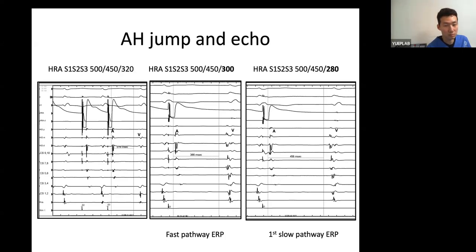But sometimes you look for the left side mitral annulus endocardially everywhere, and you cannot find that sharp potential that you saw today on the CS 5, 6, 7, 8. Then you need to search inside the CS. You target that sharpest potential. They usually get rid of the pathway. Okay, that much I can tell you.